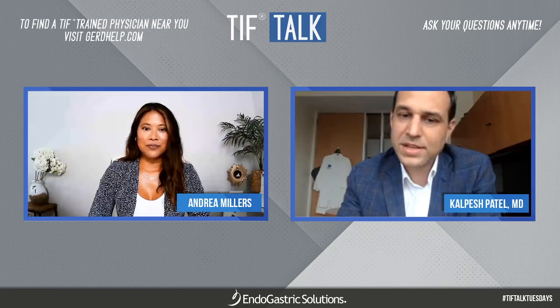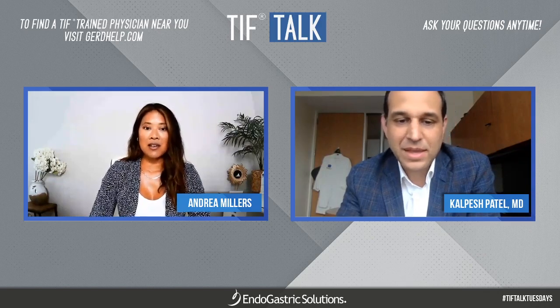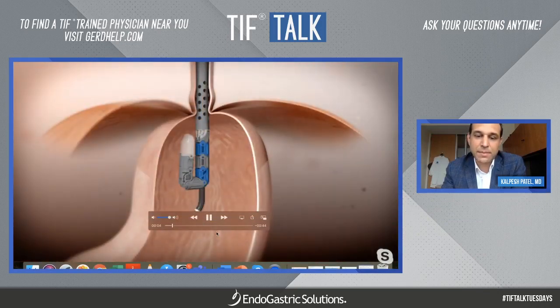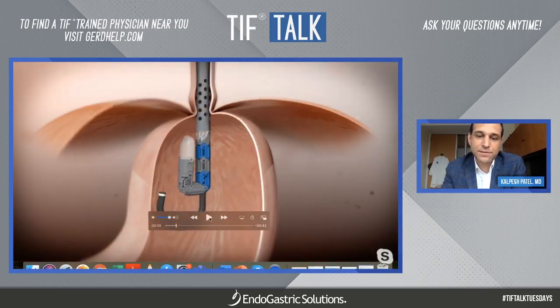Okay, can you see the video there? I can, thank you. Okay, so here we can see the camera going through the mouth down into the stomach. I'm going to pause there for a second. This is the device right here, and this is the standard camera. The camera is really showing me the view of how I'm managing the device.